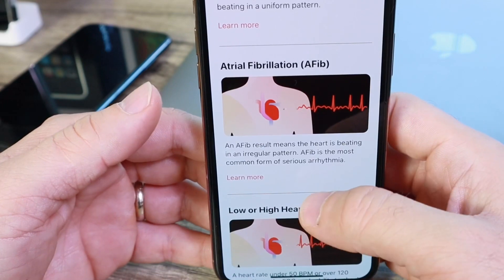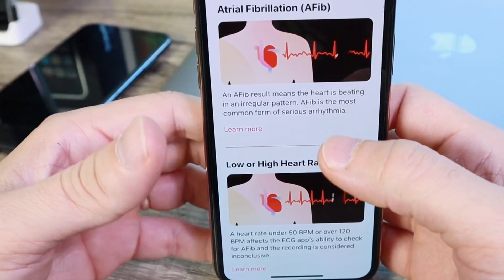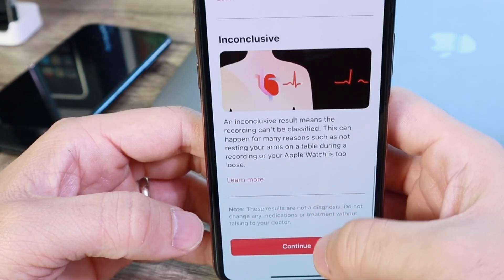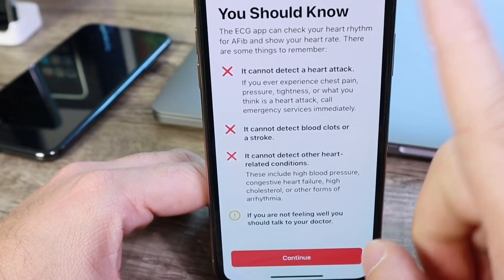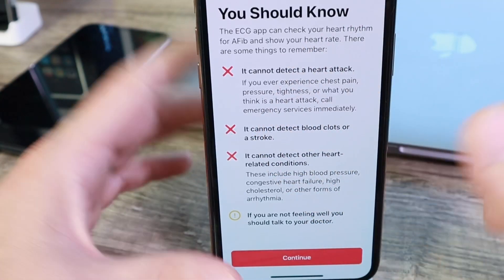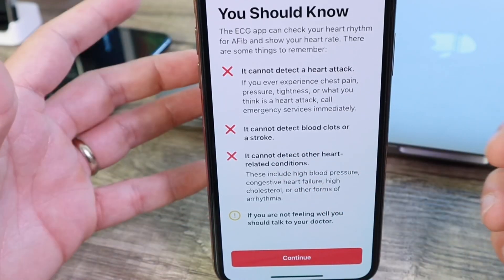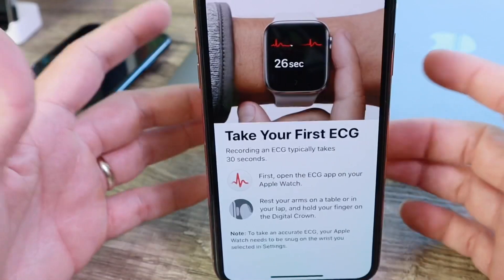If you have AFib, you have a more inconsistent and irregular heartbeat, which is also monitored by the ECG, along with high and low heart rates. The final splash screen details important information on what you should know: this will not detect any heart attacks, and this will not detect any blood clots. Be sure to read this carefully and click Continue when you're ready.